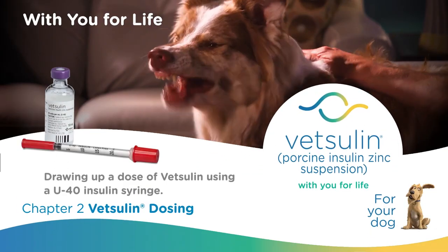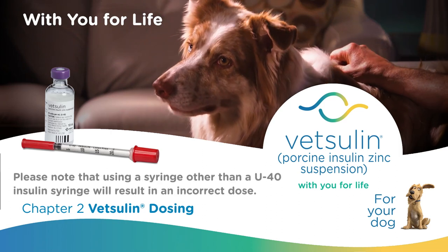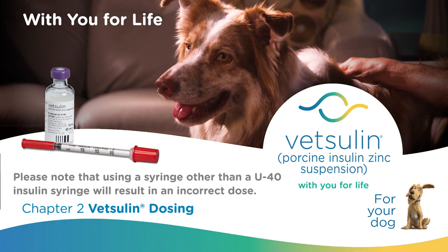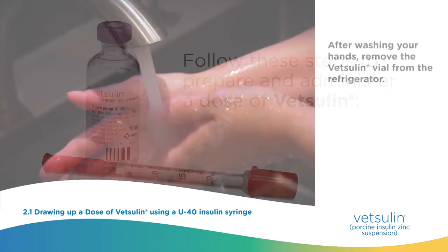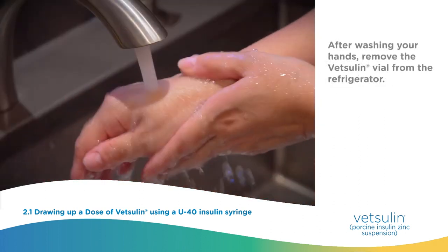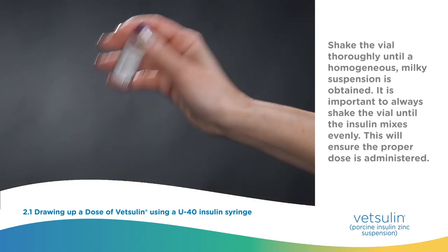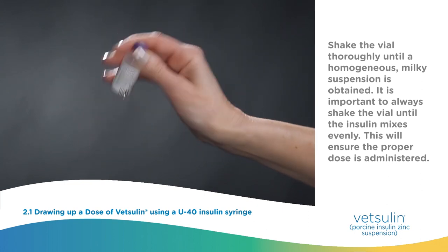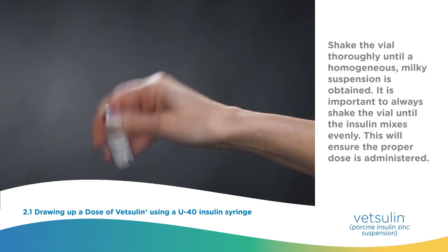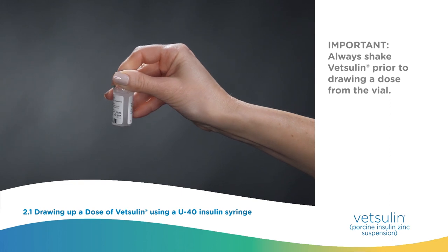VetSulin dosing with a syringe. Please note that using a syringe other than a U40 insulin syringe will result in an incorrect dose. Follow these steps to prepare and administer a dose of VetSulin. After washing your hands, remove the VetSulin vial from the refrigerator. Shake the vial thoroughly until a homogenous milky suspension is obtained. It is important to always shake the vial until the insulin mixes evenly to ensure the proper dose is administered. Always shake VetSulin prior to drawing a dose from the vial.